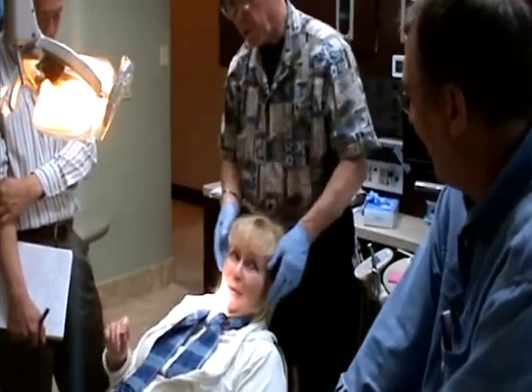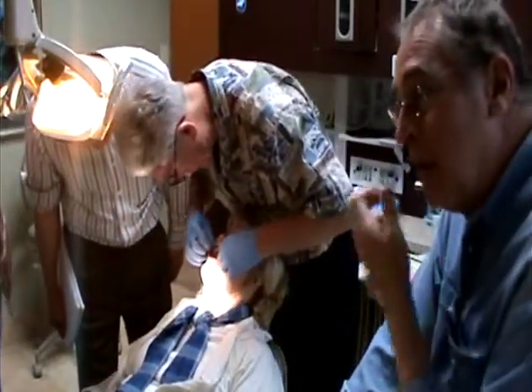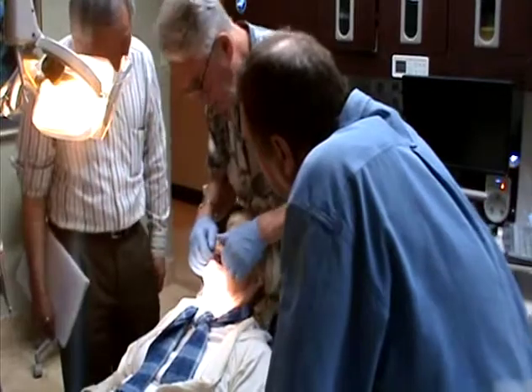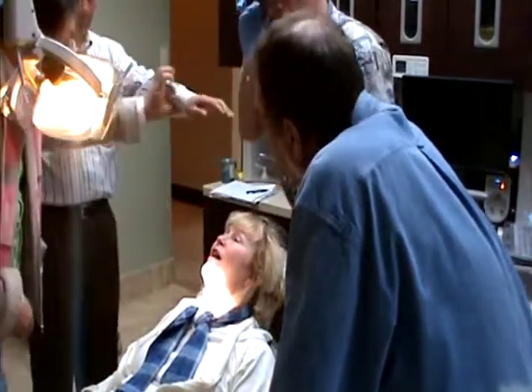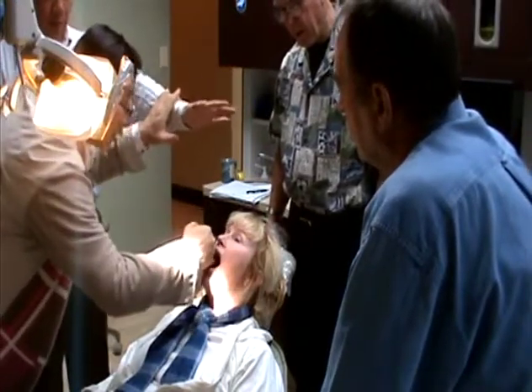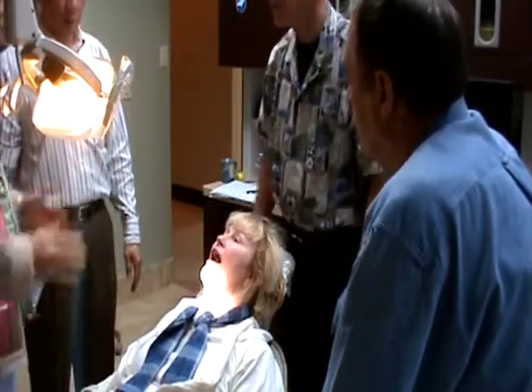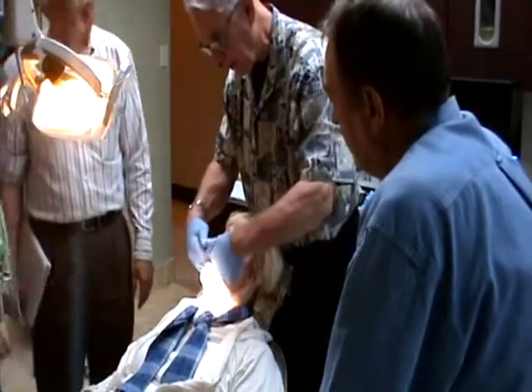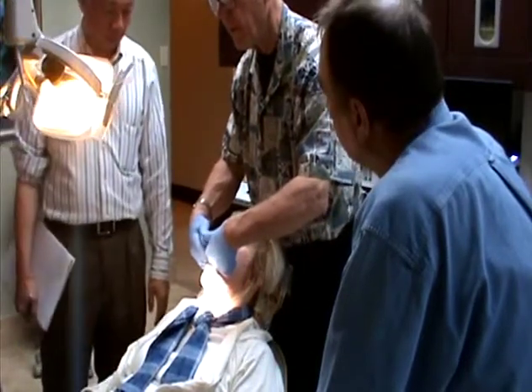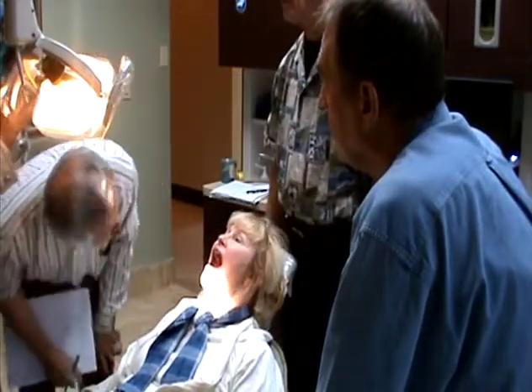And then I don't know where your maxilla is, but let's just tilt your head back a little. Well, put yourself on the Aculiner. And I think you're torqued up on the left side. The arch is narrow. Yeah, a little narrow. You can feel the mid-maxillary suture, and she's got a bulge in there. Feel that? Yeah. Teeth are inward.